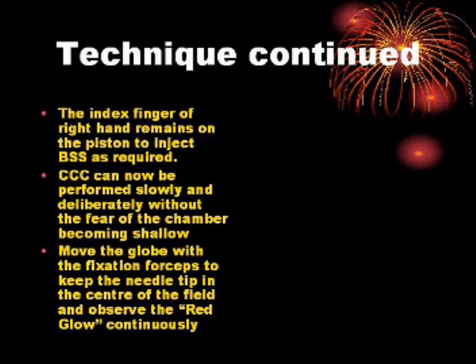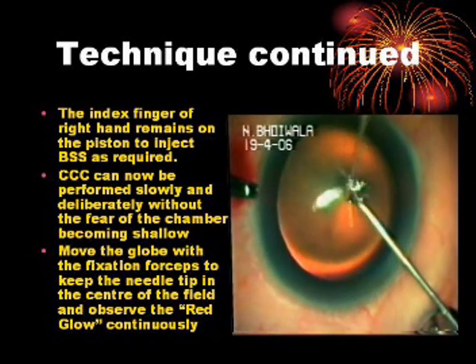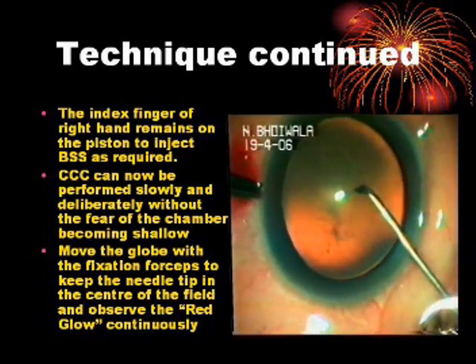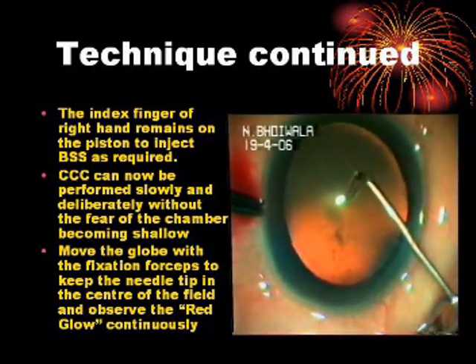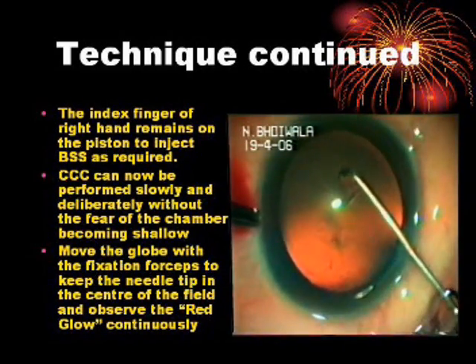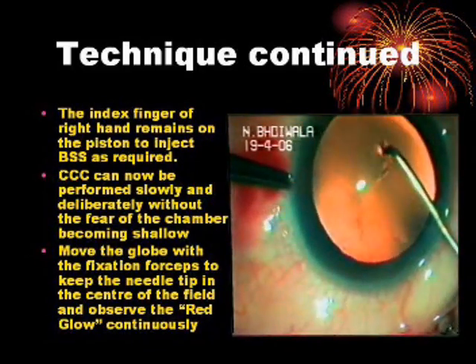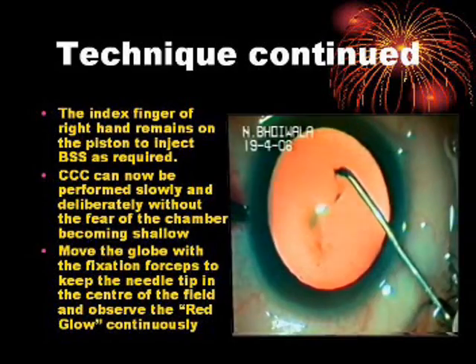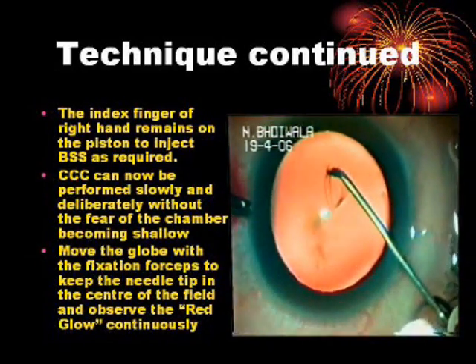Technique continued. The index finger of the right hand remains on the piston to inject BSS as required. CCC can now be performed slowly and deliberately without the fear of the chamber becoming shallow.